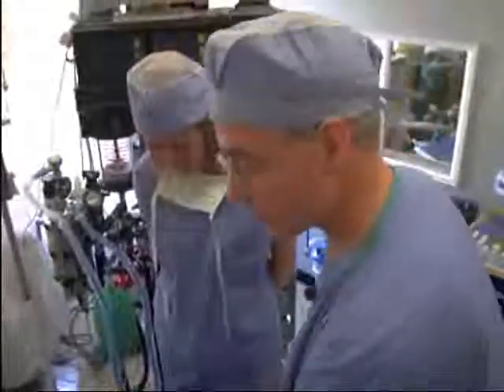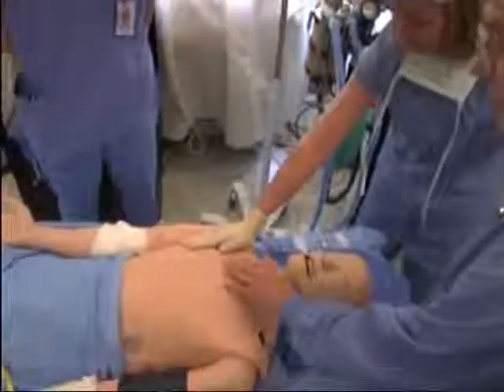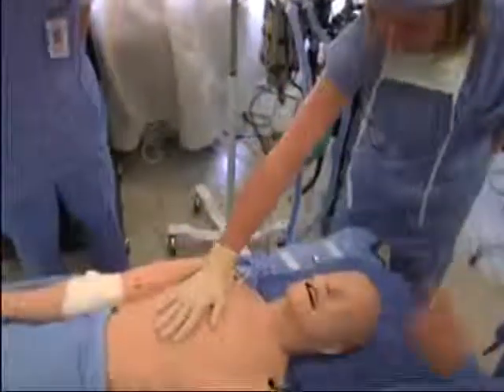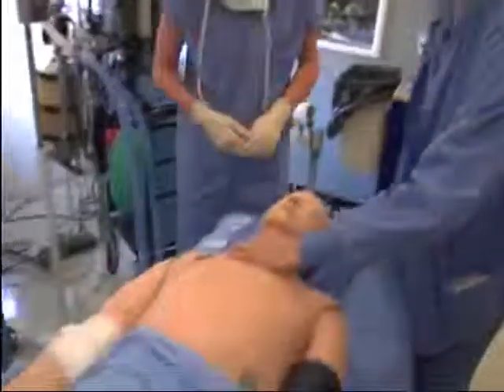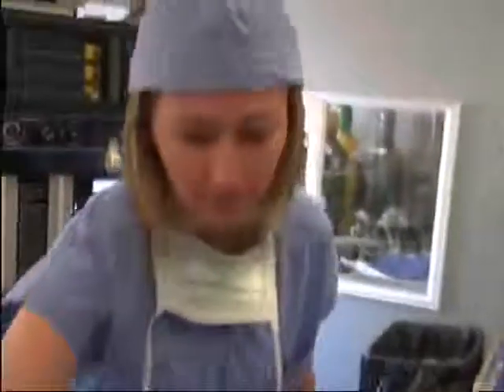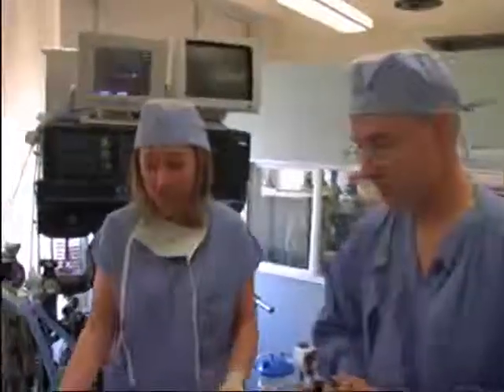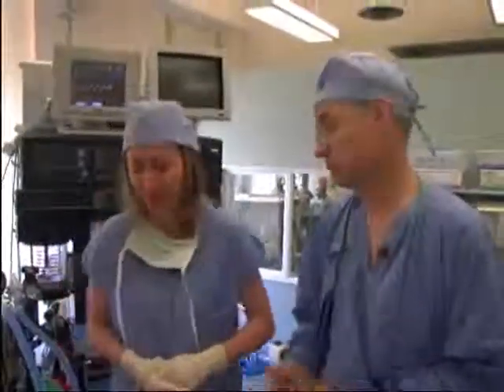Yeah, please. I don't know if you can tell, but he's breathing, so his chest is moving up and down. And if you put your hand over his mouth, you should be able to feel him breathing out. If you feel in his neck, right here, you can feel the pulses in his neck. And if we feel down on the wrist, he has pulses in his wrist. Chris is technically a robot, just a reactionary robot. Exactly. He's going to react based on what I do. So I can kill him? Yeah, but if you do, you can't charge for it.